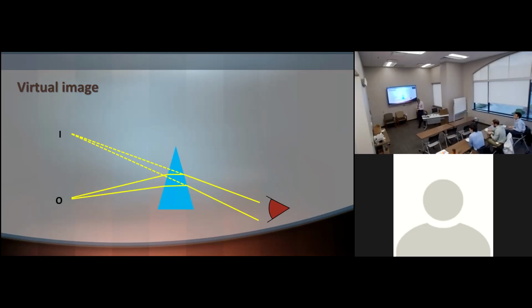I'm going to give you some hands-on practice. Everyone look at me with the prism. You will see me shifting. Put it close to your eye and close one eye. My image shifts this way because you're holding the apex in this direction. Then we increase the prism for more deviation. Or base down, if you want to hold it that way. So I jump, and it stops, right? Okay, cool. Any questions so far?